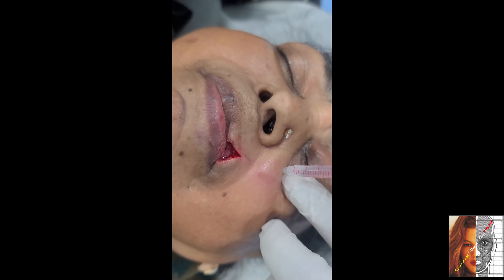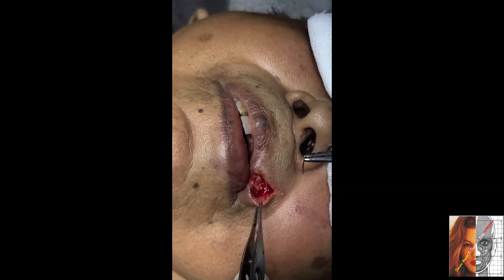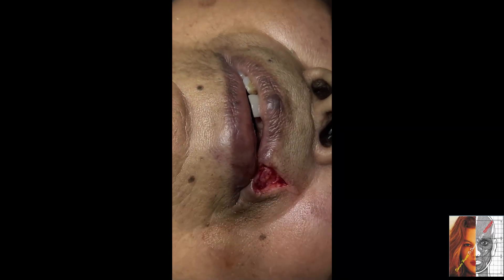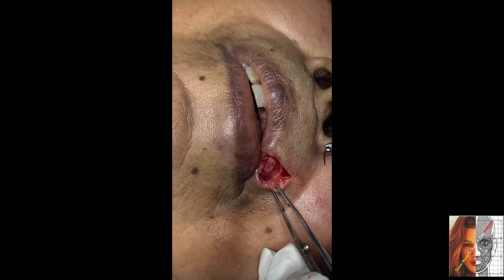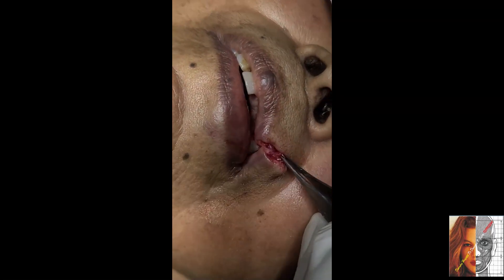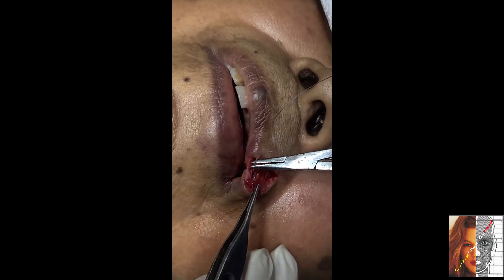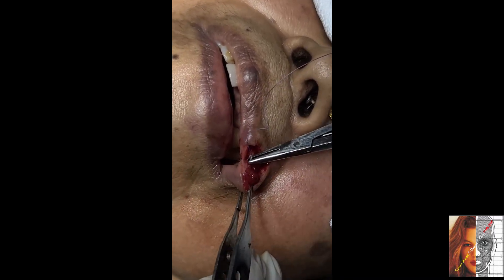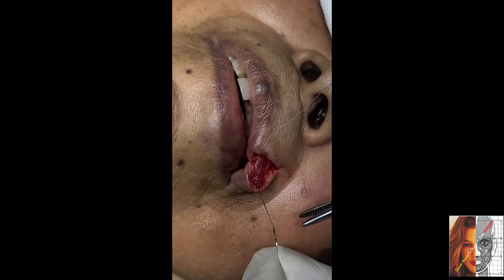This is an infraorbital block. This is a problem of the muscle also, so just find out the muscle. Now I am catching here — this is the muscle here. So now take the bite from this muscle. Take the bite from the muscle to maintain the lip seal.